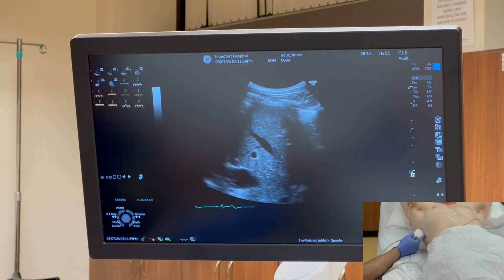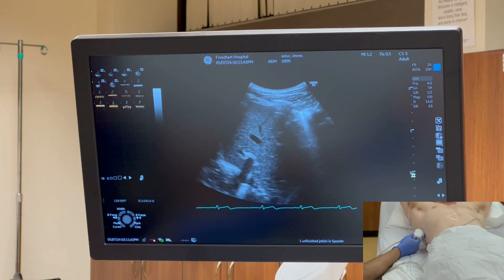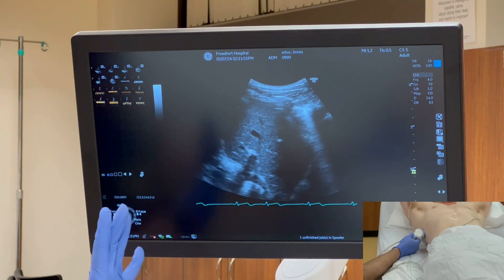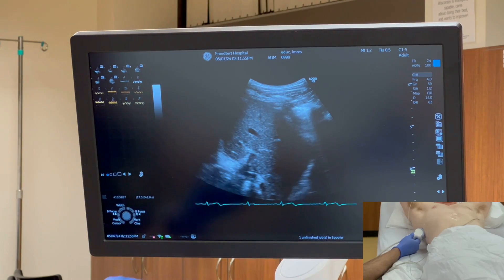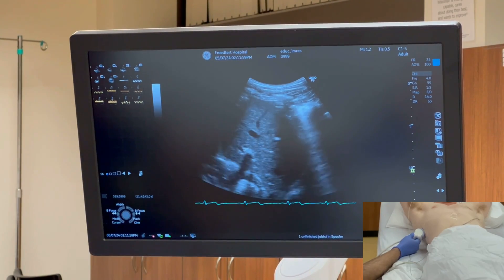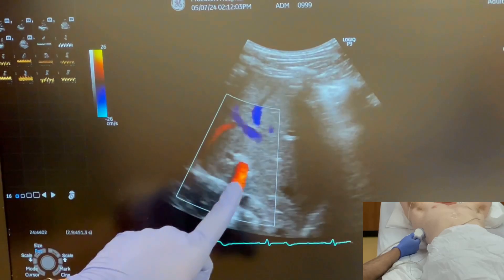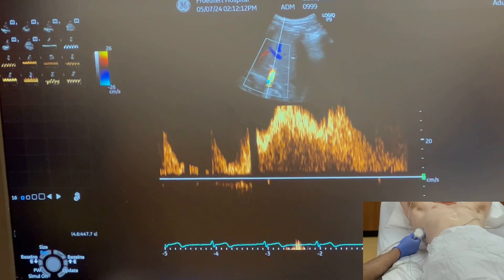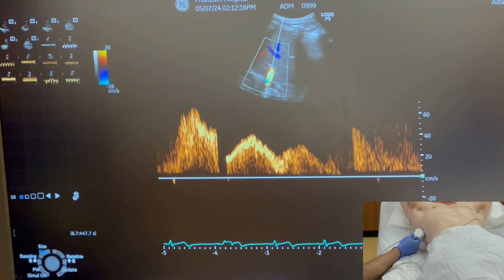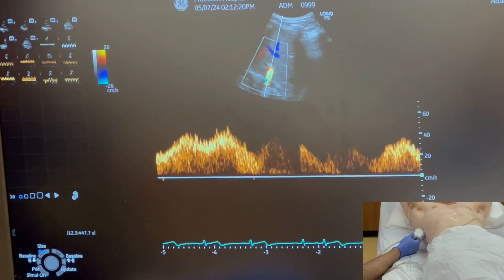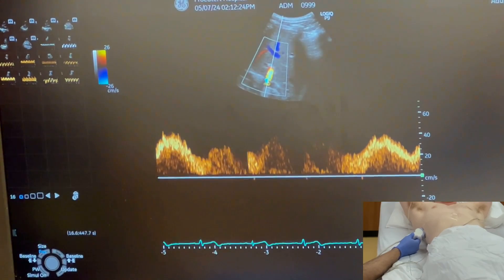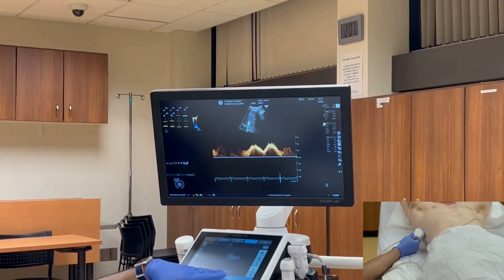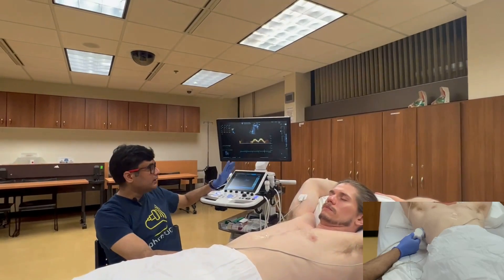After finding the hepatic vein, tilt the probe gently anterior to find the portal vein. The portal vein carries blood from the intestines into the liver. It's a very gentle movement — I'm not really relocating the transducer. On color Doppler it appears red because the flow is towards the transducer. You can see there is respiratory variation: during inspiration the waveform increases and during expiration the amplitude reduces. The waveform appears slightly pulsatile, but in otherwise healthy young athletic subjects, the portal vein tends to be slightly pulsatile at baseline — that's not abnormal.